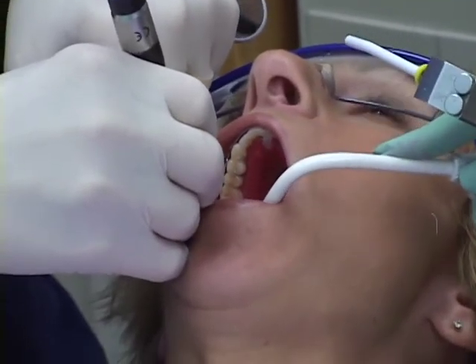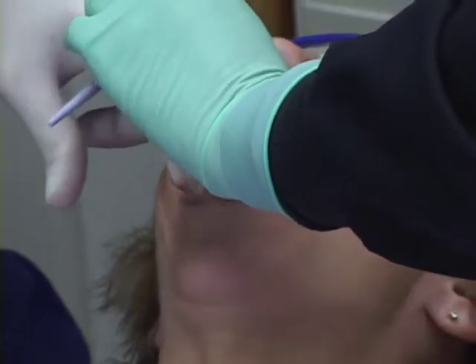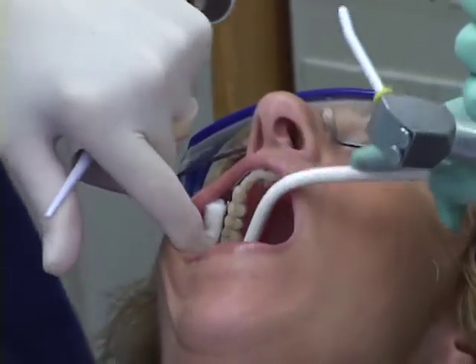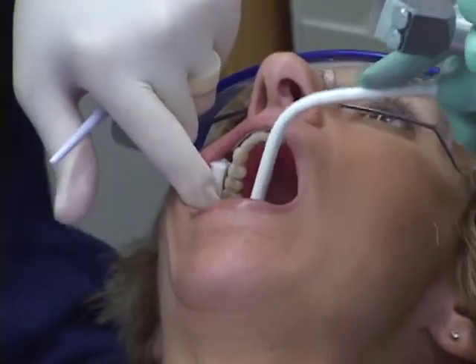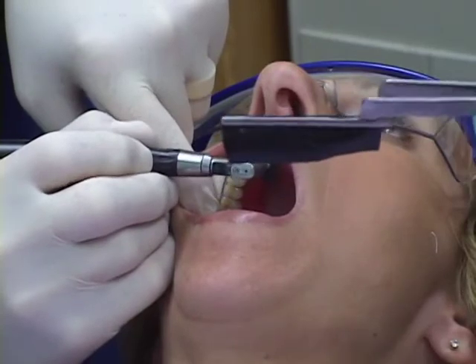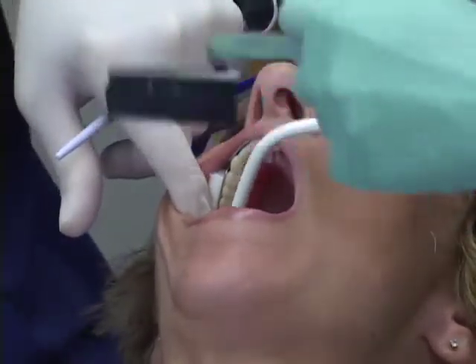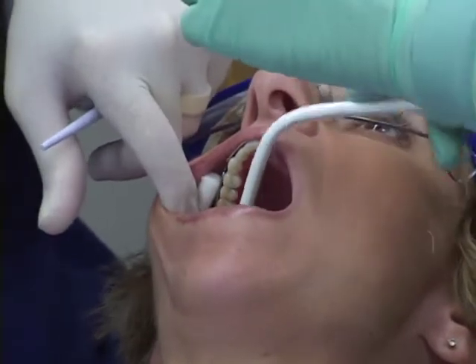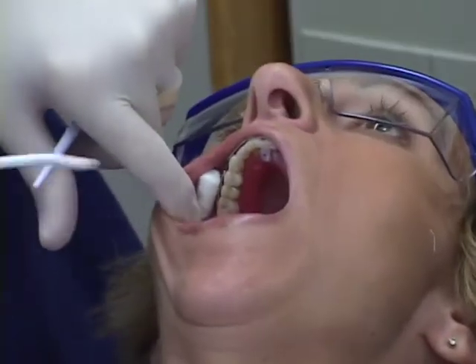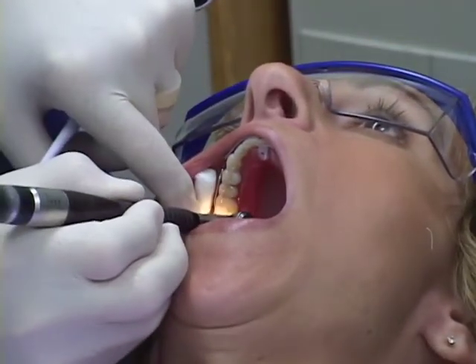And again, one thing, I'll make a note here. Again, chop, chop, chop, chop, chop. Open. Okay, and it's already to the point where that interference is gone. Right here. Okay, once again, in more flat. Tap, tap, tap. Again, we're picking up that interference here. And literally, this is how we go.